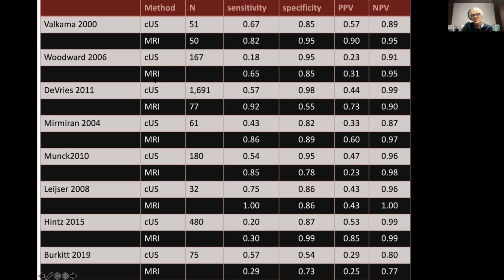The other point I want to make is that if the MRI is negative, that's the so-called negative predictive value, or shows that there's no abnormality, it's very, very prognostically powerful. So if you have a negative study, in other words, no abnormality detected, for those parents to know that the likelihood their child will have any neurodevelopmental disabilities is extraordinarily low, lower than the term-born baby that might be being born healthily in the labor and delivery that day.